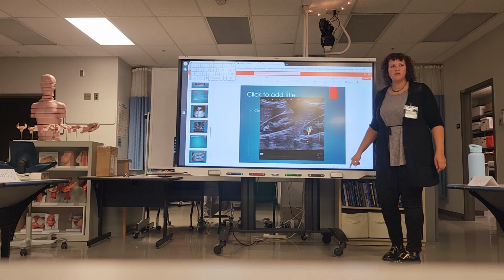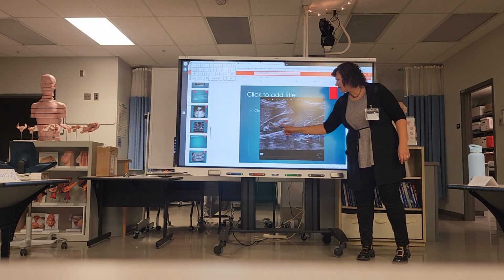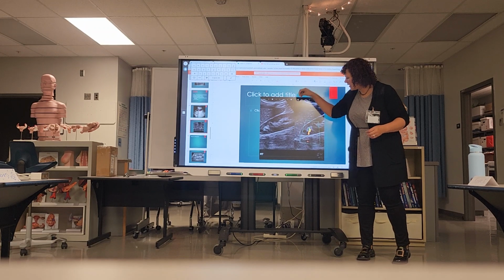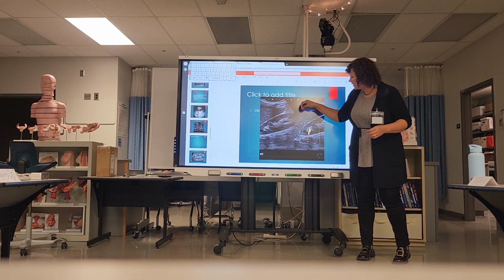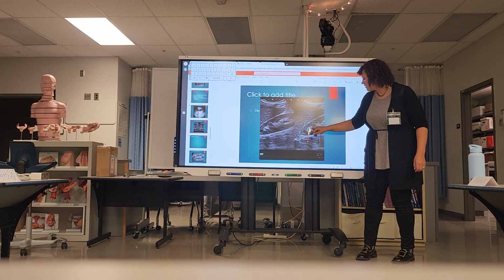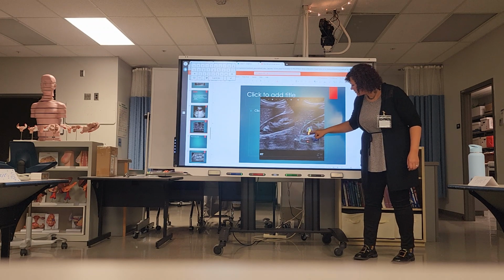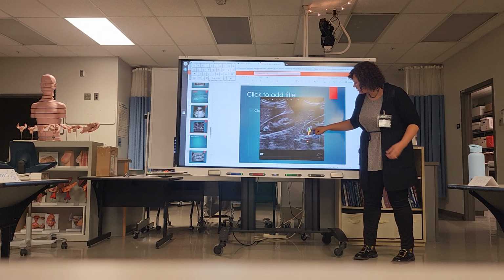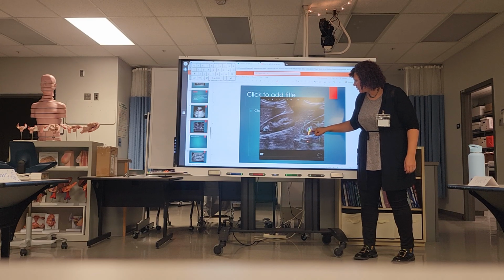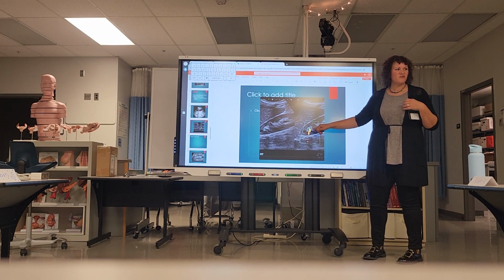It's hard to tell because there are so many other echogenic parts of the kidney, like all these vessels, and pieces of fat that look echogenic. But if you put the color box on something echogenic and it gives you this twinkle artifact, that is your big clue that it's a stone. Not every stone is going to twinkle, but most of them do.